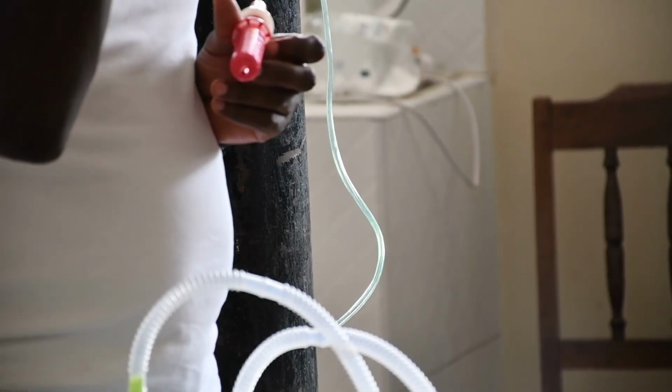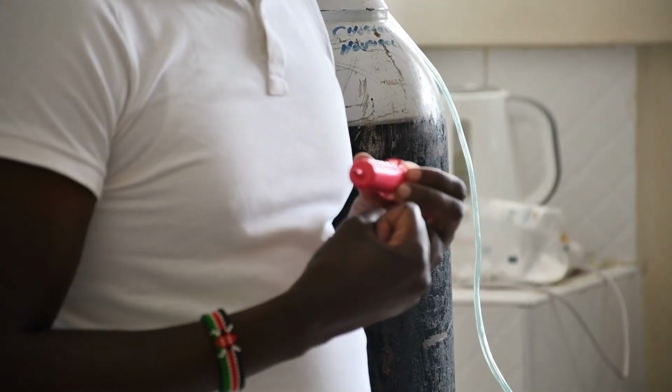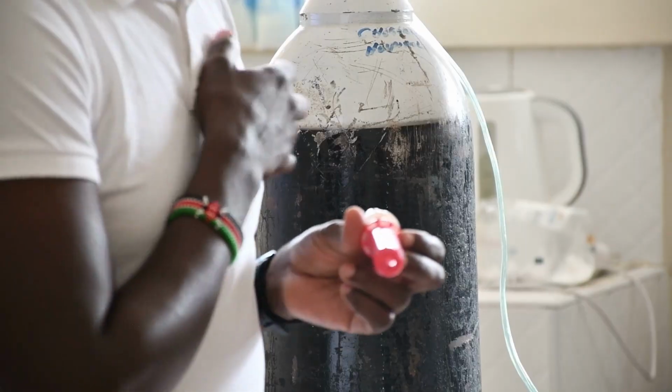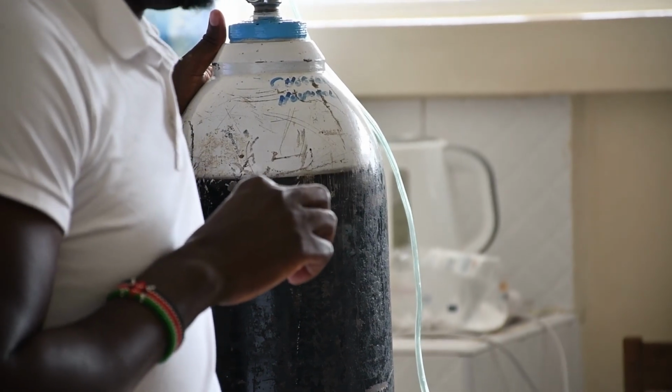It widens, so more of the ambient air will be sucked in to mix with the gases that are going in. That is how you dilute the concentration of the oxygen from this source. We all know why that needs to happen.